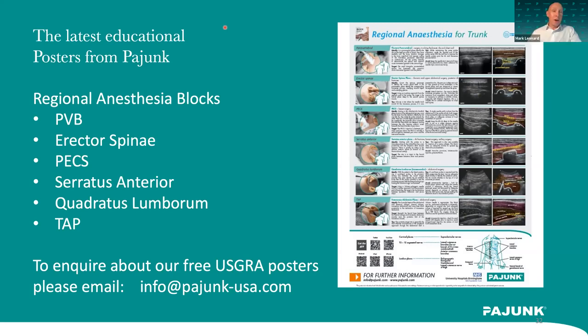Several people asked that question in their residency, for example. They were always taught to touch the rib and then come back off the rib. Obviously, with ultrasound, with a good needle, with good hand-eye technique or good hand needle technique, you should be able to see your needle at all times. But if in doubt, make sure you're aiming towards the rib and not between those spaces of the rib, I always advise.